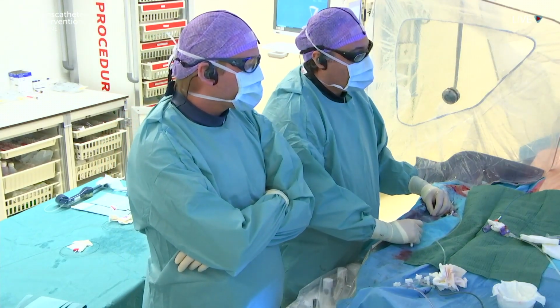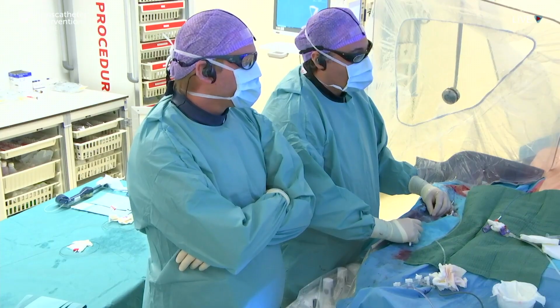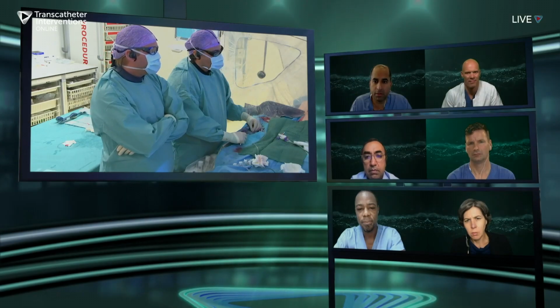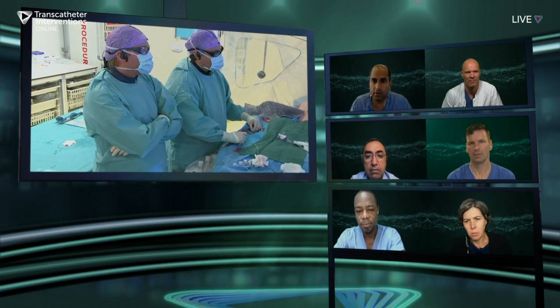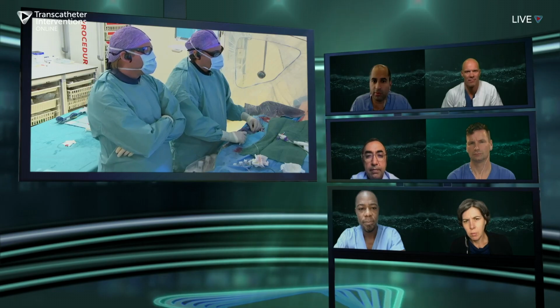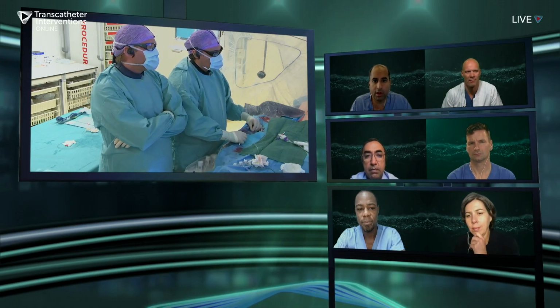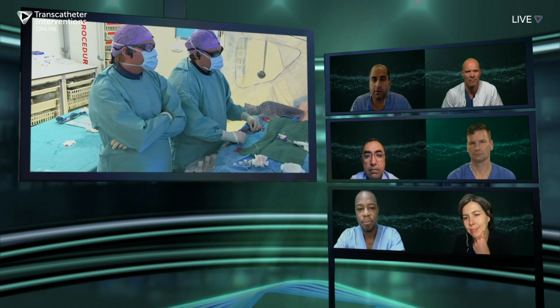Yeah, that sounds fine. We'll go to Leipzig. I would just caution you a little bit with this catheter through that collateral, and obviously it's good to get experience, but sometimes when it's this tortuous, it can be a challenge. So with that, let's go to Leipzig and see what they have in mind, then we'll come back to you and see how your progress has been.